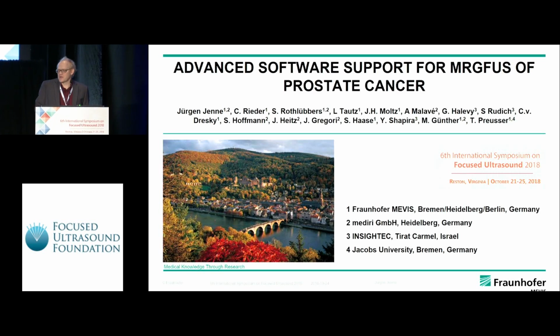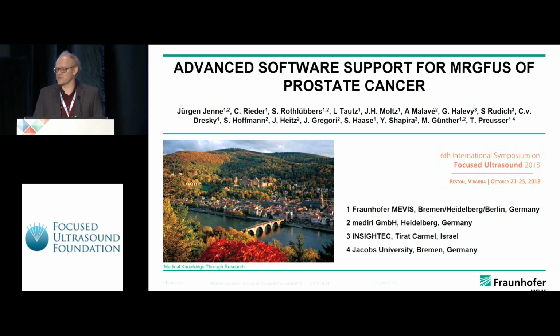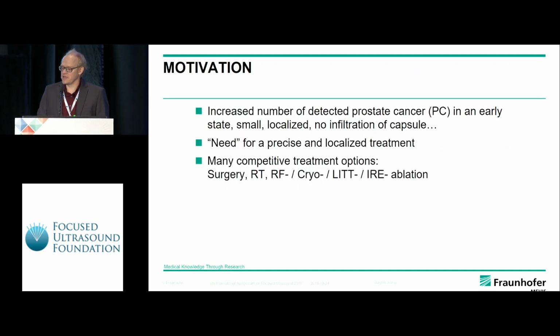I want to talk about advanced software support for MRgFUS of prostate cancer, and let me motivate this. We have an increasing number of detected prostate cancers in an early state. They are small, they are localized, they are not infiltrating the capsule, and so there's a need for a precise and localized treatment.